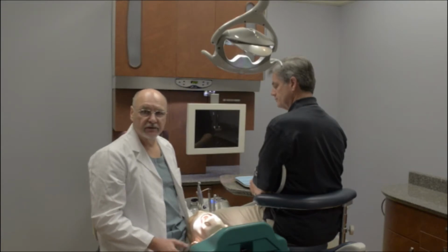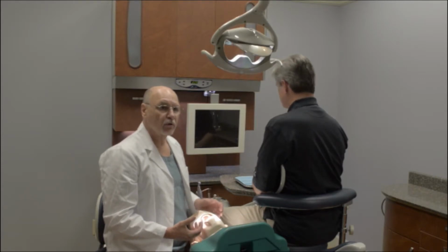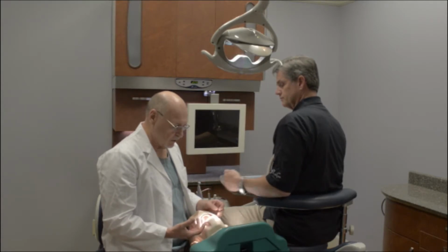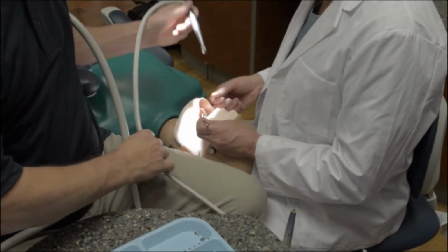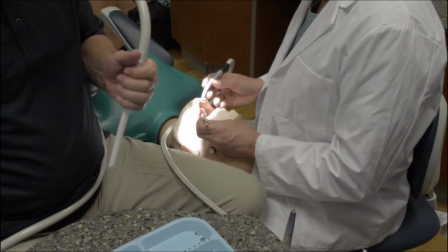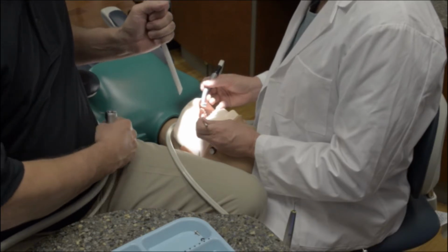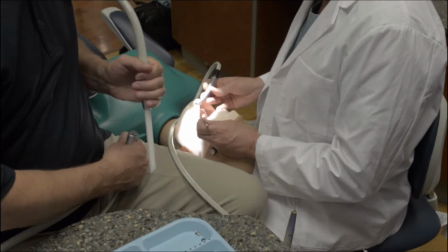After the patient's been anesthetized and we're ready to begin the procedure, the assistant is in position, and we're going to have the transfer of instrumentation at this point. So the mirror is brought up in position, and then we're going to bring up a handpiece. The assistant's going to hand the handpiece to me by using a reverse grasp of the handpiece initially, and then bringing it to me with the burr facing away from the patient, so there's never even a remote chance of cutting the patient. Now, I then turn the burr into the patient.